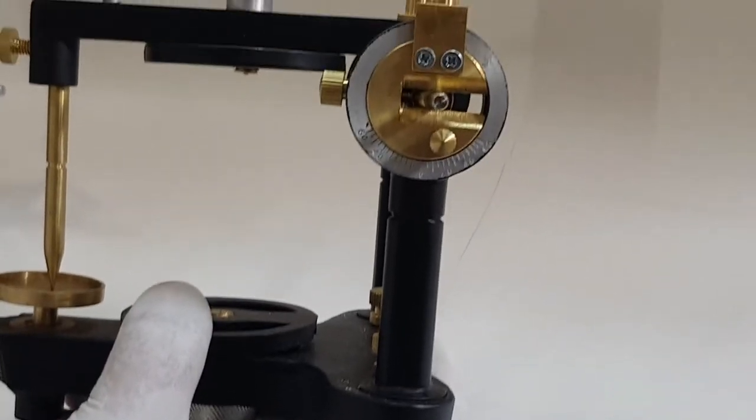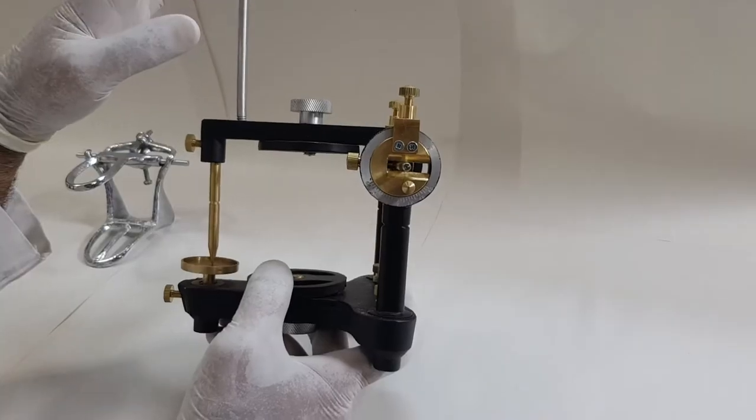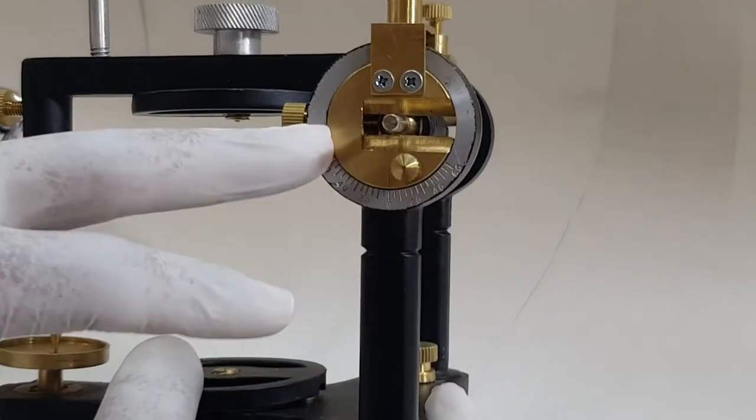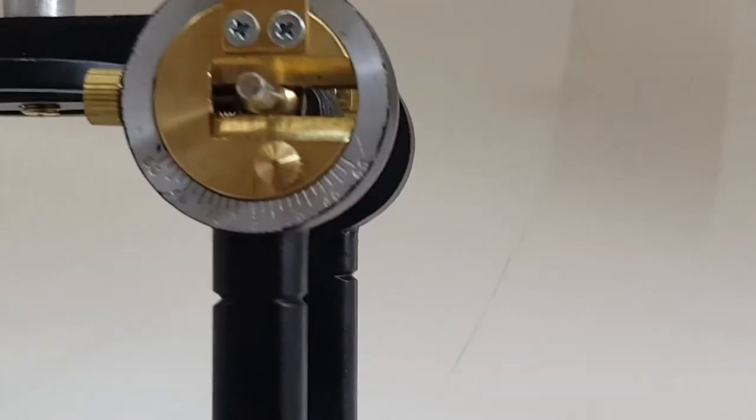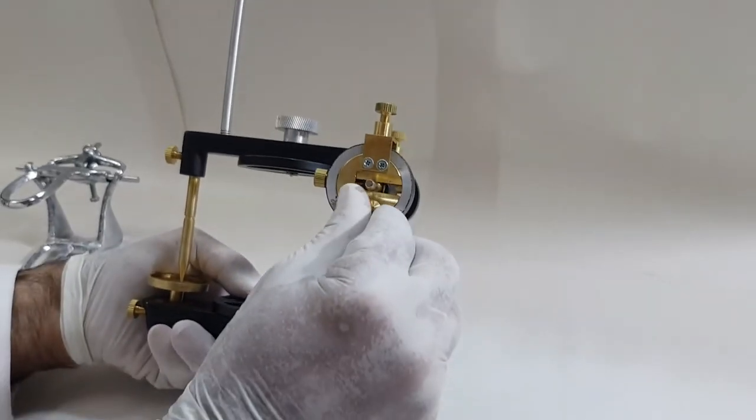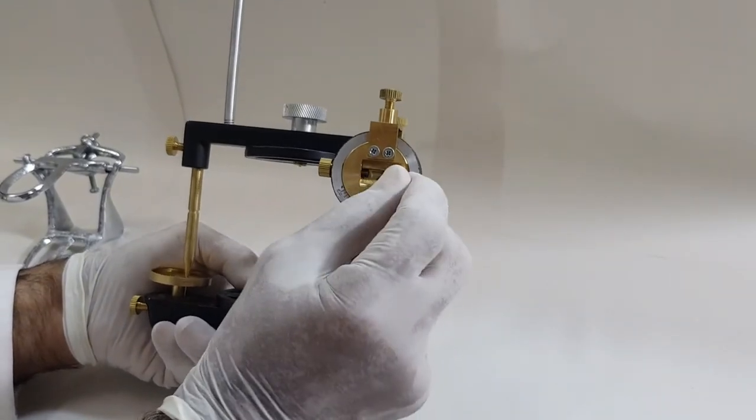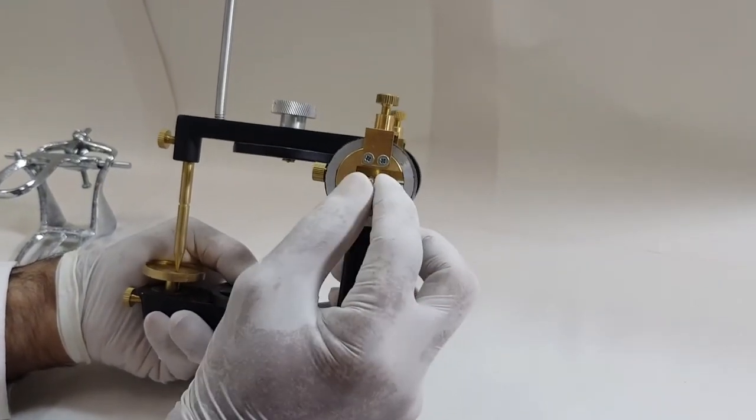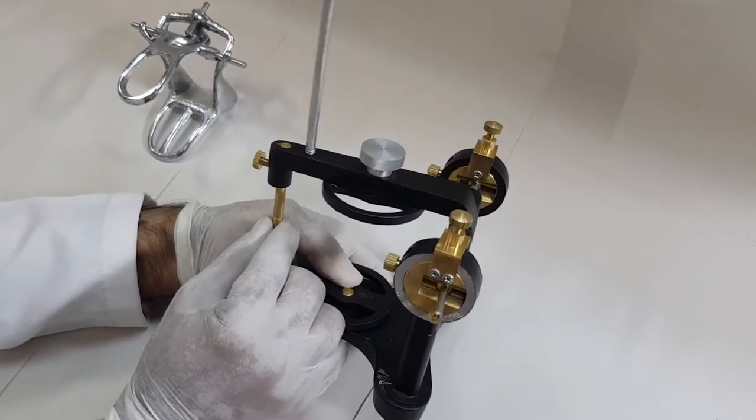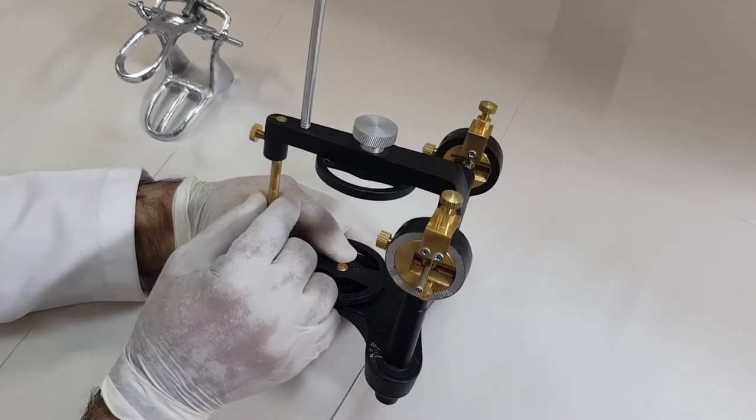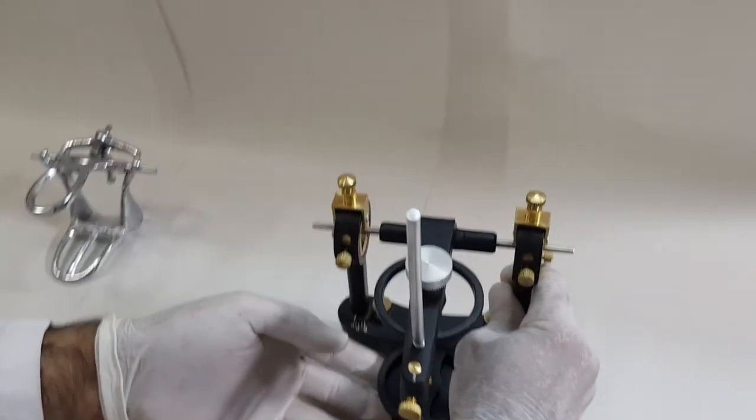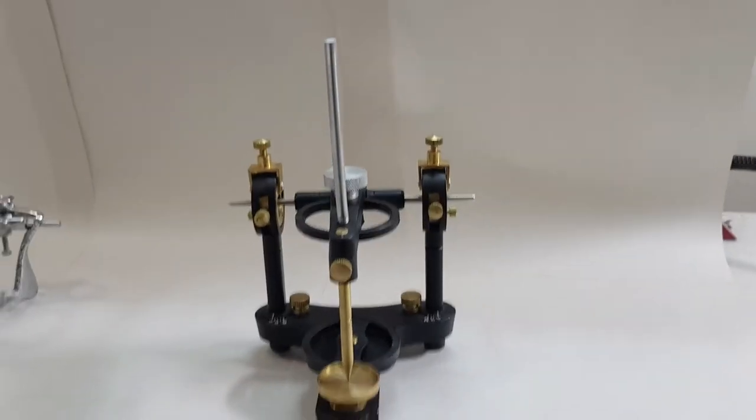So it's sort of a reverse of the temporomandibular joint anatomy. Similarly, the glenoid fossa or over here, the condylar element, the assembly here, or the slot which you can see inside, this is attached with the lower part. And if I unscrew this and I can move this, so the condyle is rotating sidewise. But similarly, the maxillary member is moving, which is not possible in the real anatomy. So this is a semi-adjustable non-archon articulator.